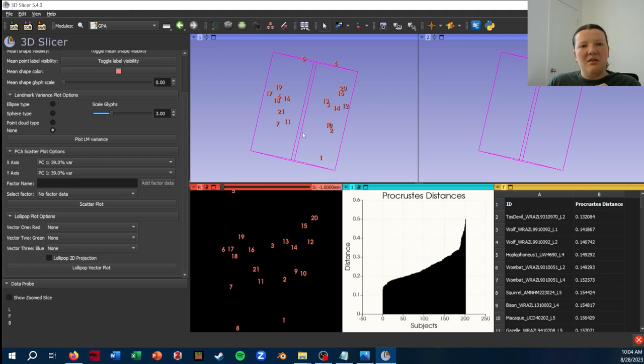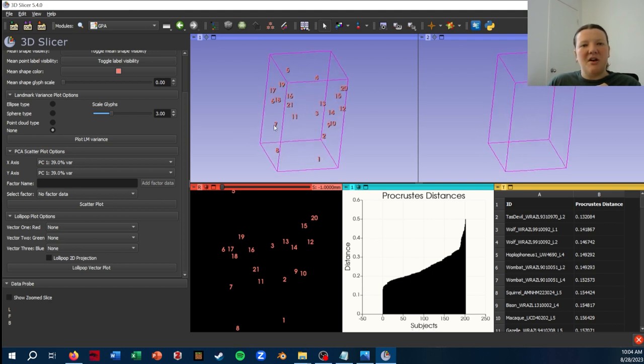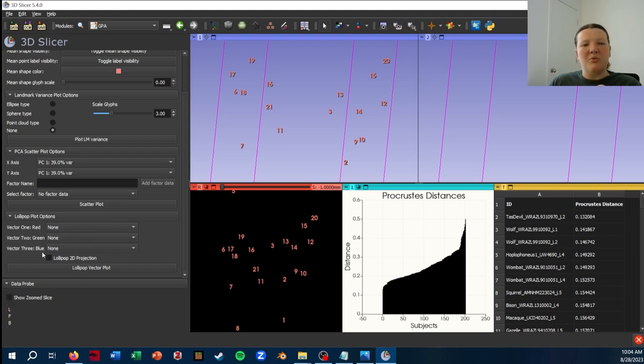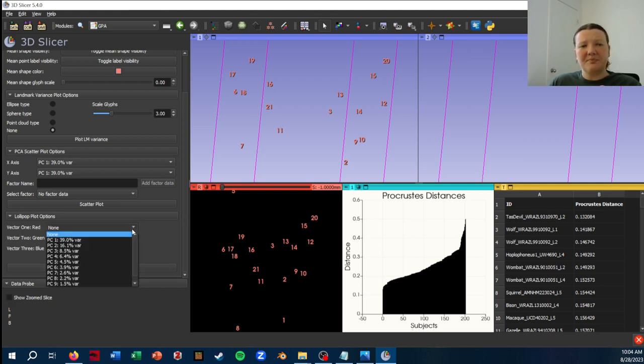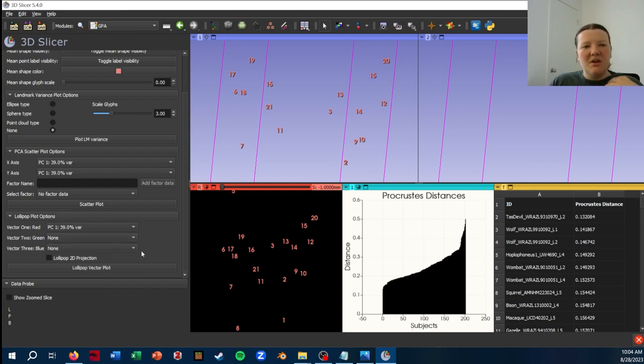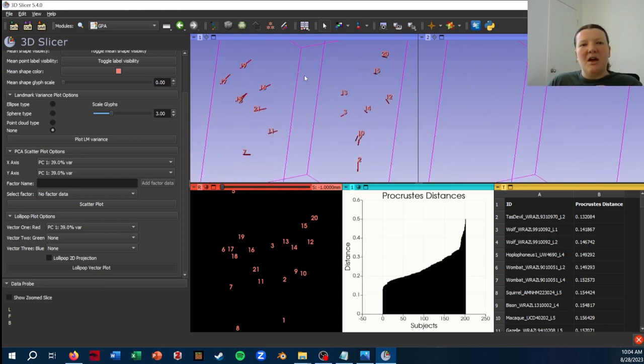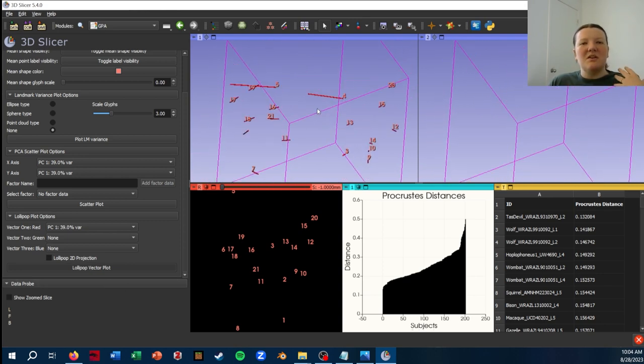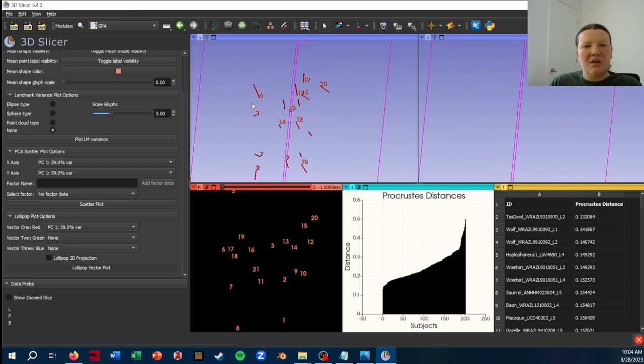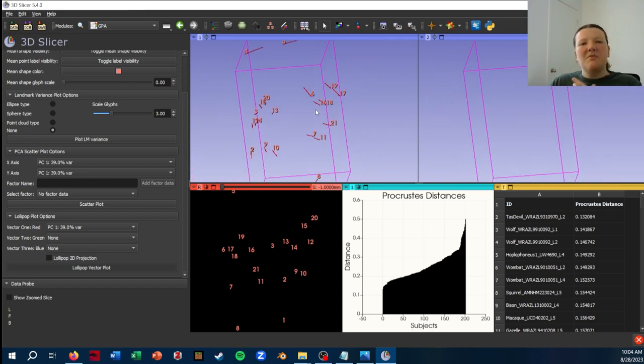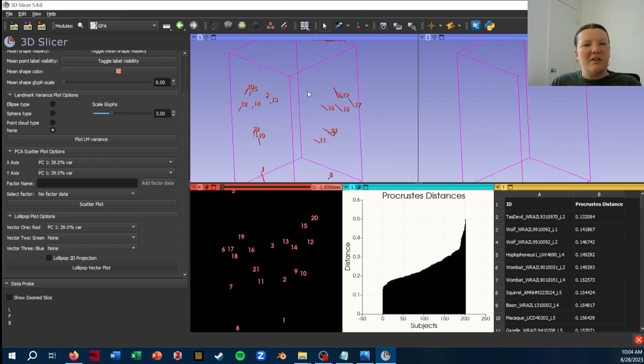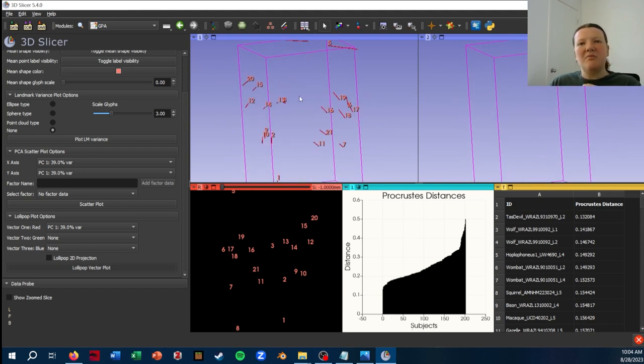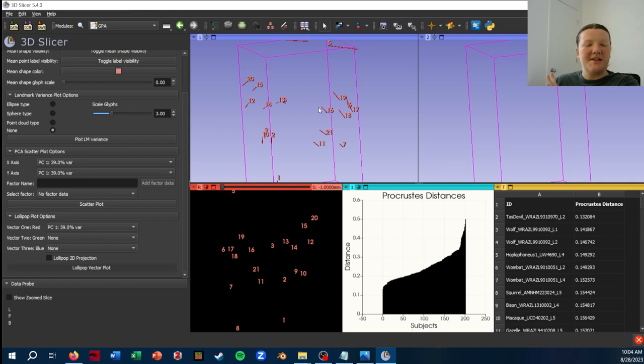And then we also have an option to look at the lollipop vectors. And you can do this by, you've got a red, green, and blue option, and then you can select which PC you want to visualize. So I'm just going to show PC1, click Lollipop Vector. And now what this is showing is the direction that the landmarks are moving. If I remember correctly from negative to positive along the PC, this might be of interest to you. I don't find this visualization particularly helpful, so I'll get to what I find really helpful for visualizing these shape differences in a second. And I'm going to turn this back off.